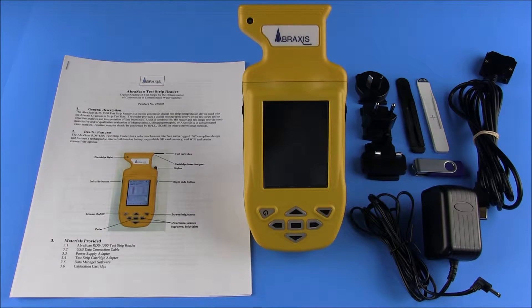The AbraScan RDS-1500 test strip reader is a second generation digital test strip interpretation device for use with Abraxas strip test kits. The reader provides a digital photographic record of the test strips, an objective analysis, and interpretation of line intensities.